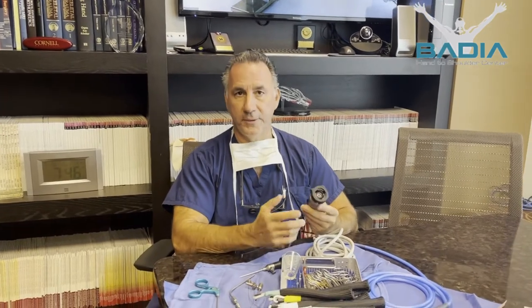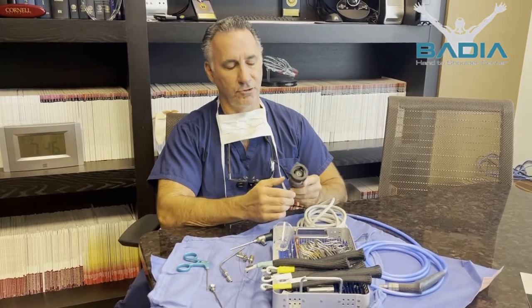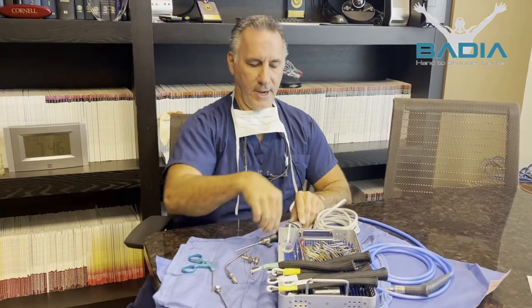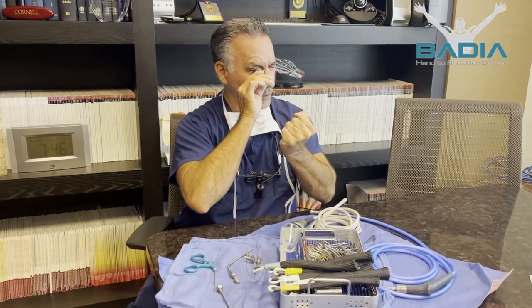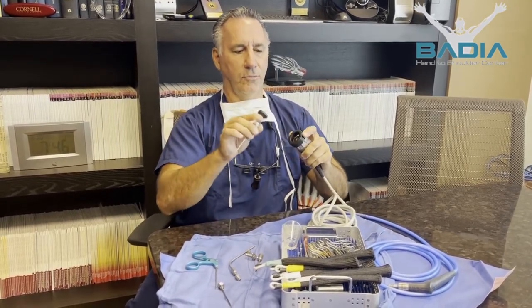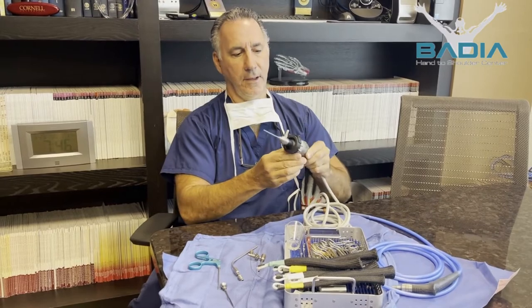A lot of people ask us what arthroscopy is, so I figured I would explain that. This is a minimally invasive technique, first done about almost 50 years ago by Watanabe from Japan, in the knee, where the camera is at the end here. They would look inside, and I can see right now magnified, but later years we would attach it to a camera. This is a fiber optic instrument.